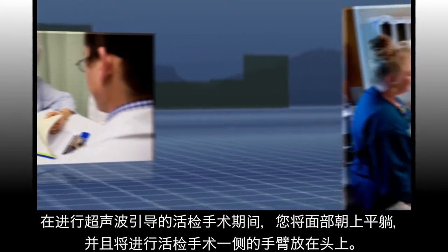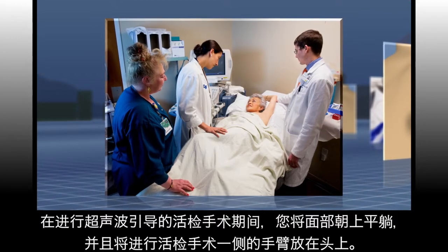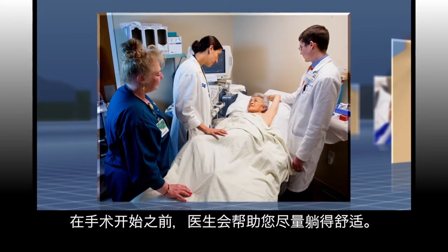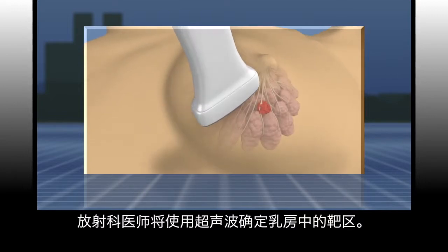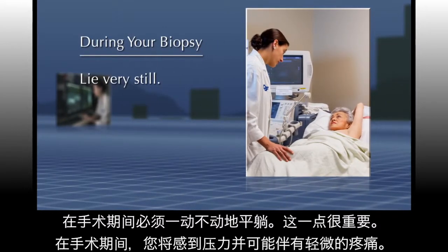During your ultrasound guided biopsy, you will be lying on your back with the arm on the biopsy side above your head. Before the procedure, you will be helped to find a comfortable position. Using the ultrasound, your radiologist will identify the target area in the breast. It is important that you lie very still during the procedure.